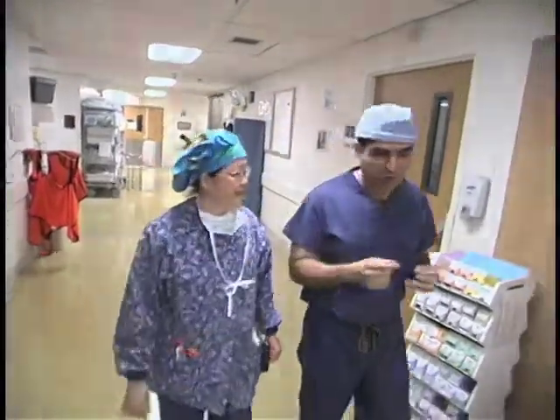The other aspect of robotic prostatectomy is obviously the side effects associated with the surgery. The two main side effects that most surgeons talk about to their patients is control of urine, or urinary incontinence, and erectile function. And with the robotic prostatectomy, we can do a very careful reconstruction and sparing of the nerves that are used for erections. And this way, the majority of patients can expect to regain their urinary control and sexual function.